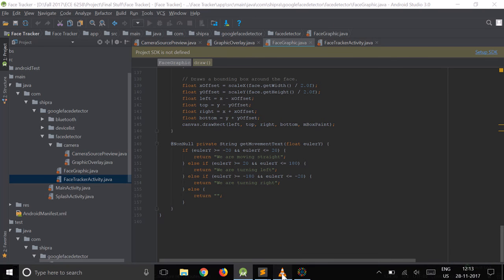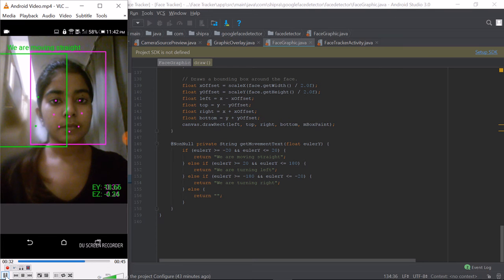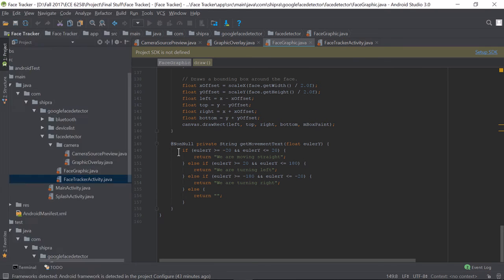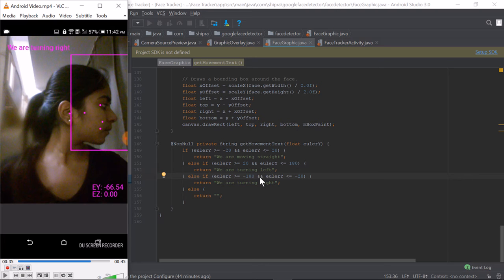Now, though we have a very high precision, we can probably go down to 2 to 3 degrees precision while we are moving, but just for the feasibility of the project and easy definition, what we have done is we divided our y plane into three sectors, which says going straight, left, or right. If required, we can also divide these sectors into smaller, more definite sectors. Say the plane of the y-axis, our neck movement from left to right, imagine it to be 180. We can divide it into sectors of 10 degrees each, so we can have 18 sectors. That way we can have more precise control of how the end device moves. What we have tested is on various z and y planes, the error does happen, but it is within a range of 2 to 5 degrees.